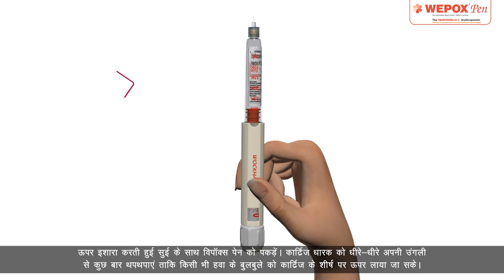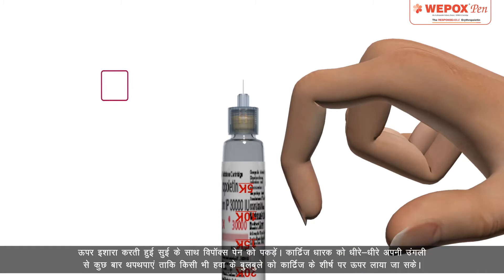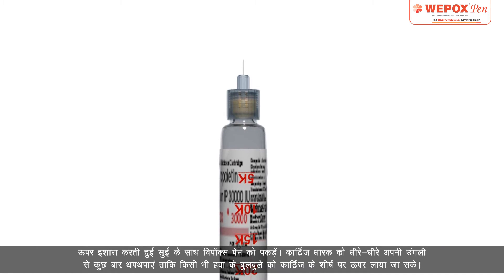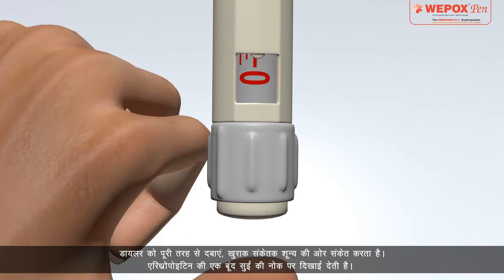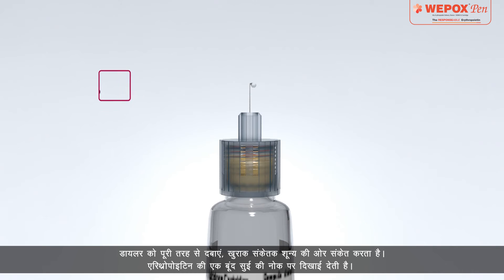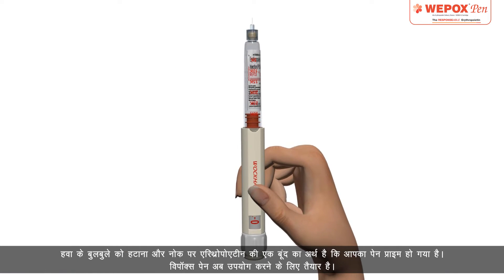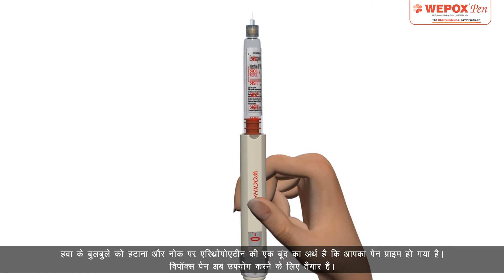Hold Wipox Pen with the needle pointing up. Tap the cartridge holder gently with your finger a few times to raise any air bubbles to the top of the cartridge. Push the dialer completely — the dose indicator points to 0. A drop of erythropoietin appears at the tip of the needle. Removal of air bubbles and a drop at the tip means that your pen is primed.